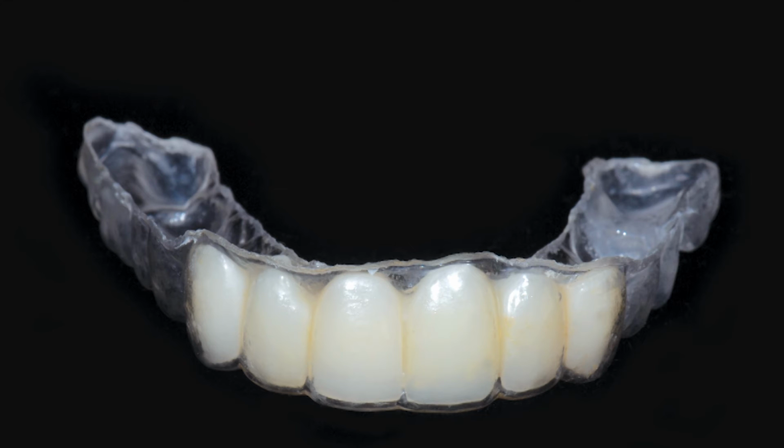Because the maxilla exhibited an anatomically correct ovoid shape, and there was no significant rotation or movements desired for the remaining posterior teeth, the treatment plan called for preserving the original form of the upper arch and the positions of the remaining maxillary dentition. The goal was to maintain the edentulous span of the 6 anterior teeth, canine to canine.